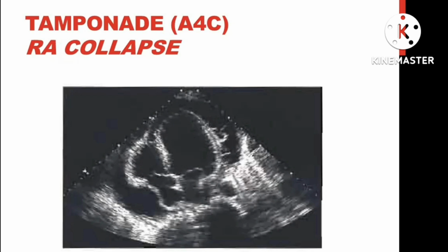Okay. But you see, the problem is you need to understand the pressure difference in the atrium and the ventricle. Okay. Which one is higher pressure? It is the ventricle, from right and left. Left, right? And then between the right ventricle and the right atrium, it is the right ventricle. Okay. The easier to collapse is the atrium. Okay.